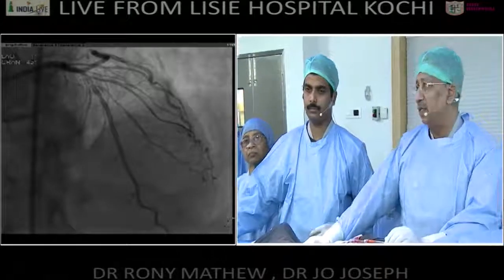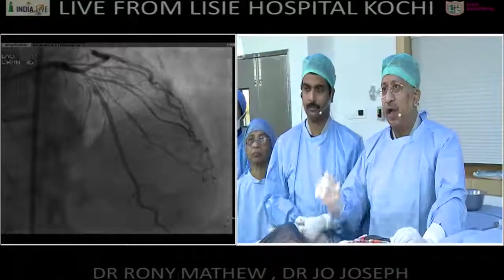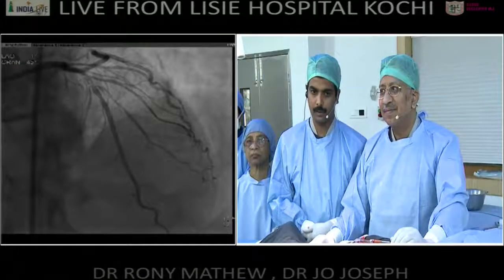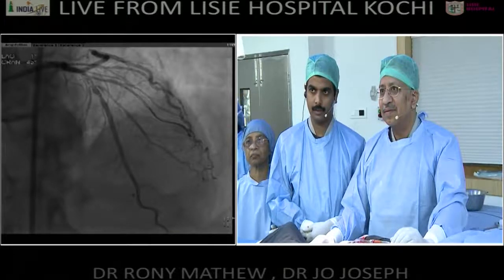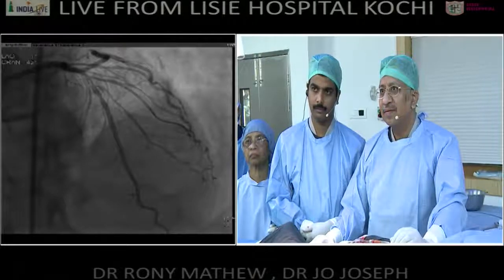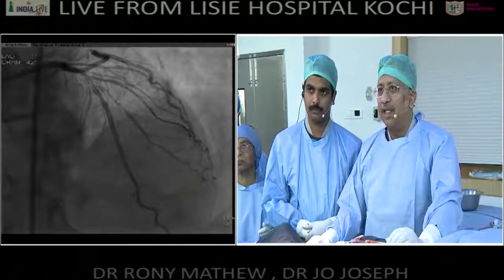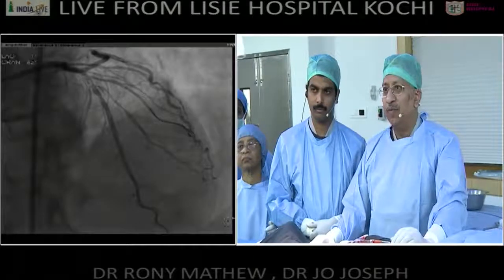So what we decided is we'll probably go for the DK crush. Dr. Panja did an OCT run over here. Unfortunately, both the D1 has a reasonable size, that means intermediate size. There will be difficulty, I think, to place the 2-stent DK crush at a time. So D1 and D2 are a reasonably equal size. Yes, I think that's a good point that you made about that D2. I am going to tackle the D1 because I think that's slightly bigger than the D2.